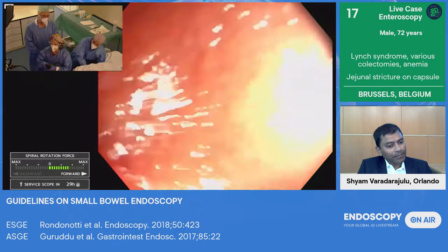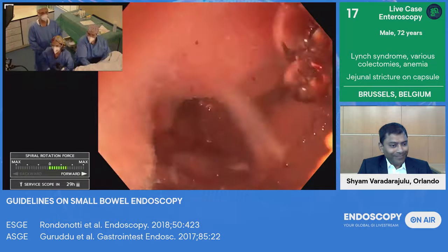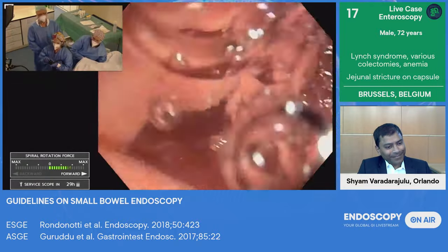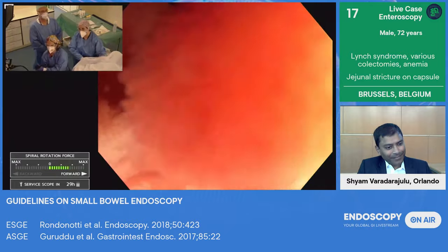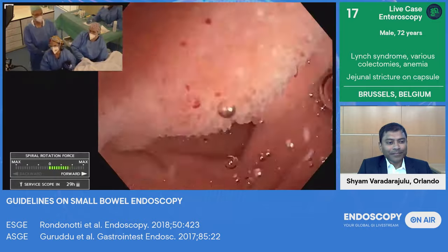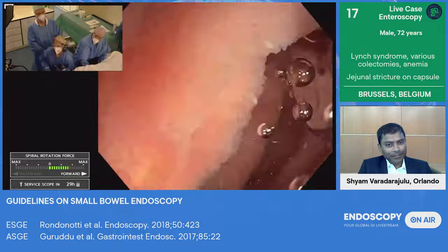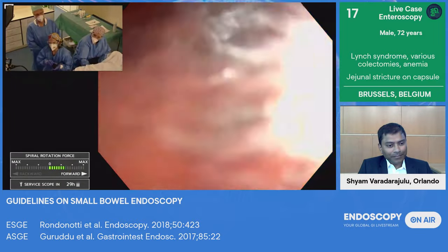Of course, this is probably not a very good case for a live demo, because you know that enteroscopy can be boring a little bit, and as long as we struggle, we do not learn many things. But looking at the case, I'm quite sure that we will have some angles where we will stop like that one, but then we will be able to pass it and we will reach the lesion. So I would not be discouraged very early in such a case. We have seen that the lesion was very well visible, so I would definitely continue for 10-15 minutes if necessary to try to reach the lesion.